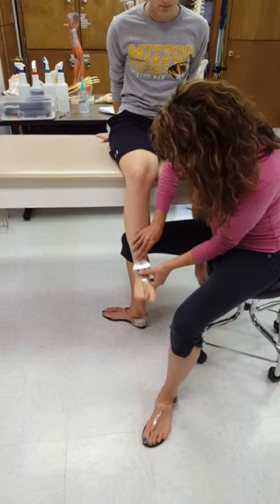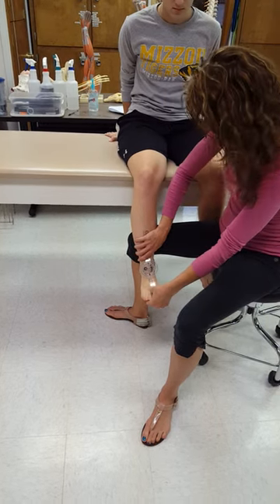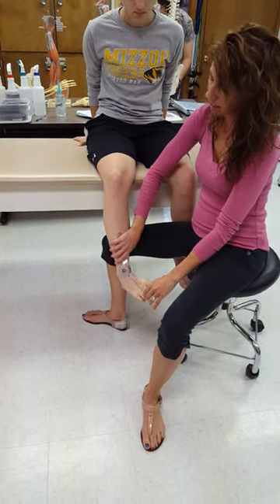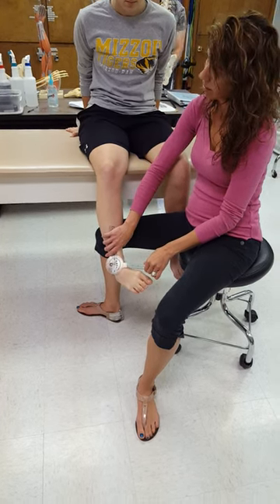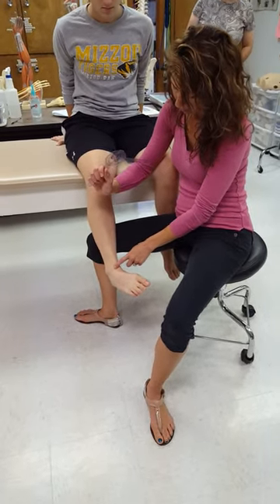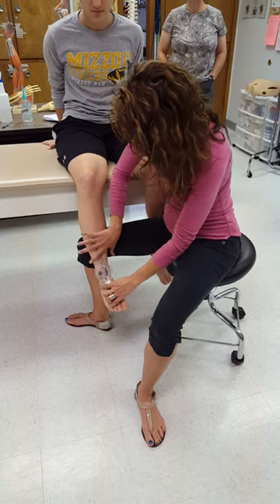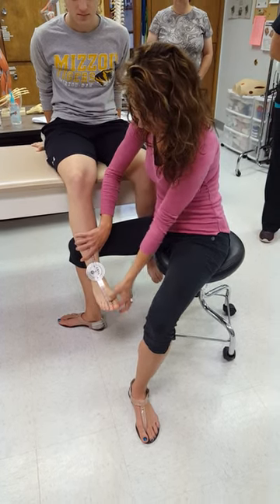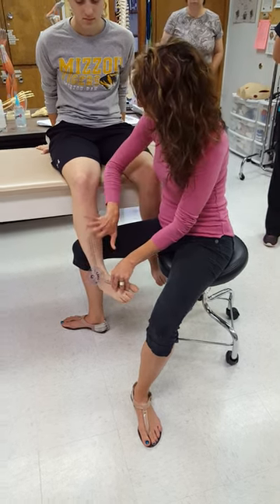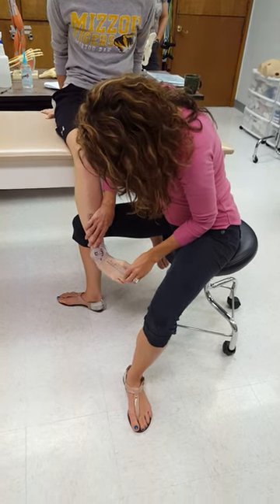Ask the patient to turn the sole of their foot towards you and go as far as they can. The goniometer tends to shift, so there's a big degree of error if you don't stabilize your fulcrum. Keep the movable arm going with the second toe, and control the goniometer from shifting by keeping it right over that midpoint with both hands.